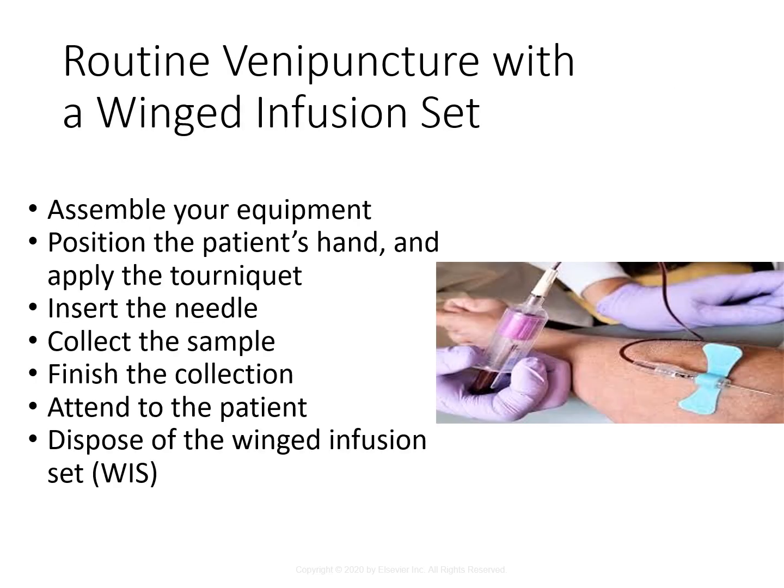Again, routine venipuncture with the winged infusion set is going to essentially be the same as the other ones. It's just going to be a different needle type.